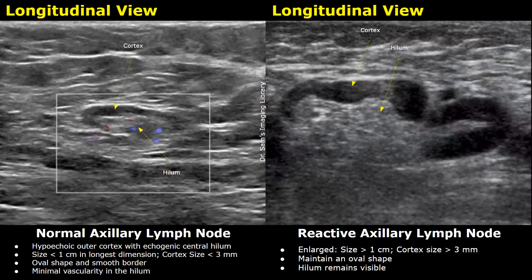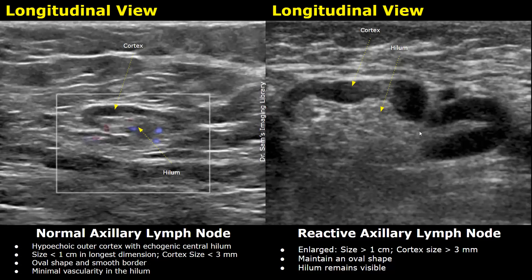This is another image showing a reactive axillary lymph node. We can see it is enlarged — its size was more than one centimeter and the cortical thickness was greater than three millimeters. The oval shape is maintained and we can also see the central fatty hilum.